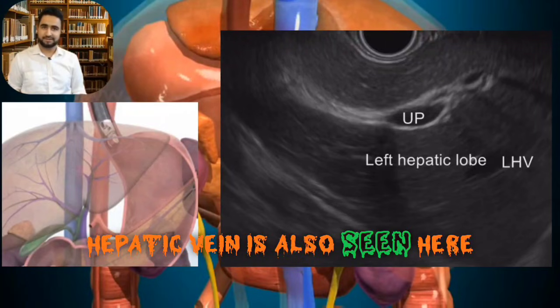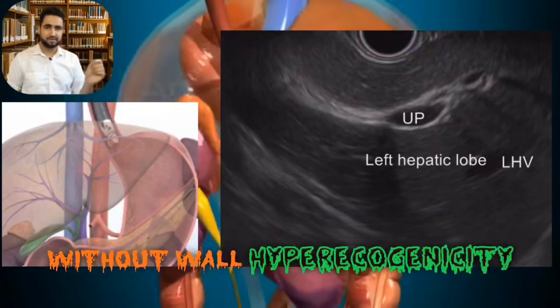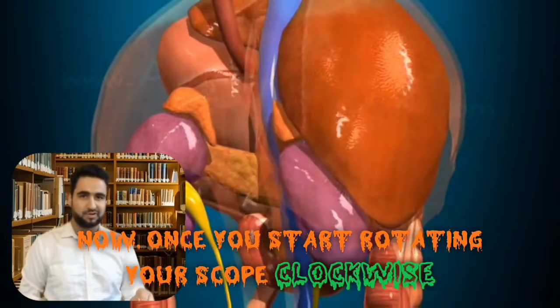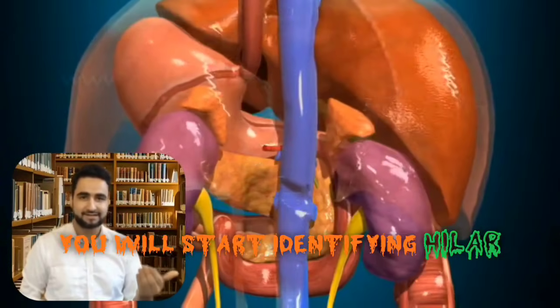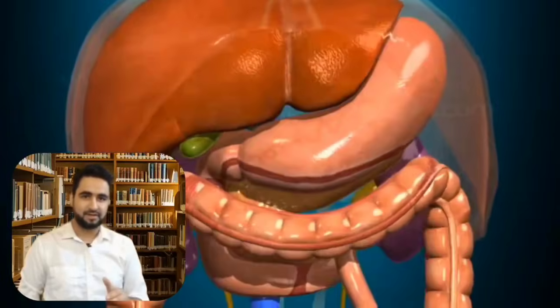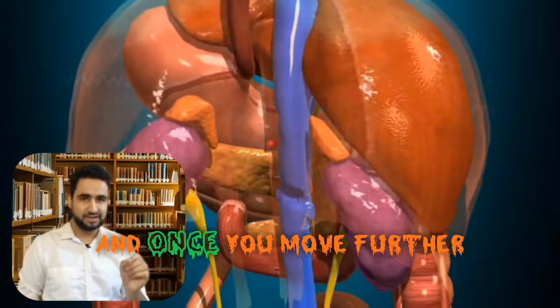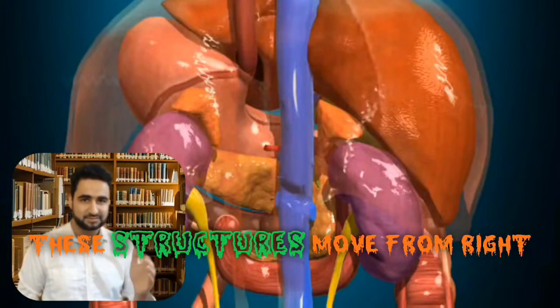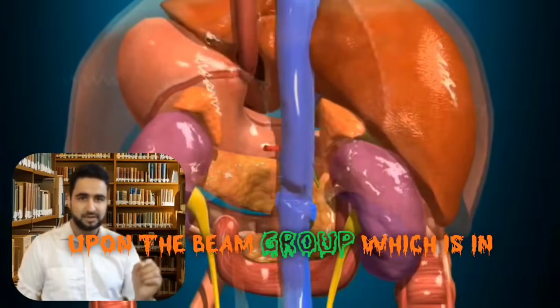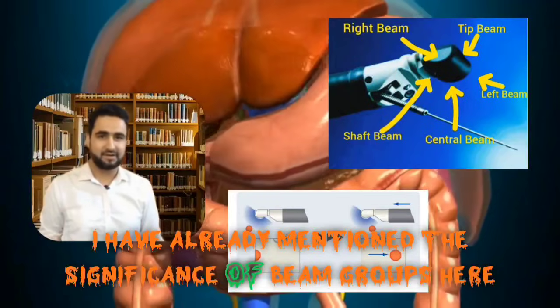On the right side of your screen you can see the hyperechoic wall of the portal vein contiguous with another hyperechoic curvilinear echogenic structure, which is the ligamentum venosum. The hepatic vein is also seen here as an anechoic oval structure without wall hyperechogenicity. Once you start rotating your scope clockwise, you will start identifying hilar structures, as they are on the right side of your scope, and you will notice them appearing on the right side of your screen.